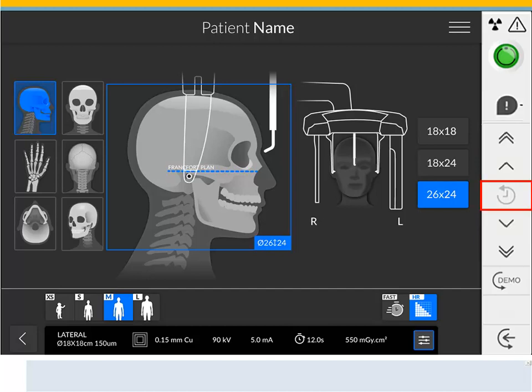Patient Data History: If a patient was previously examined, the unit will detect it from the patient's record history and this icon will turn orange. The Parameter Settings, or Patient's Morphology, and the Height Adjustment Buttons for Column will also turn orange.